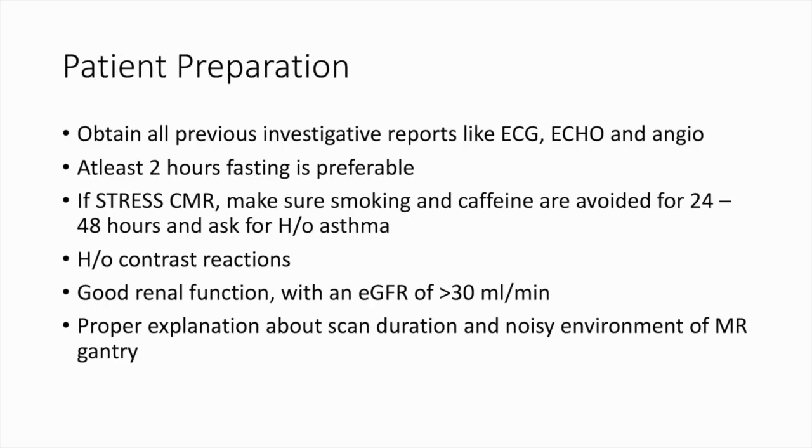Proper patient preparation is an important step in cardiac MR. Always obtain all previous investigative reports like ECG, echo, and angiography. At least 2 hours of fasting is preferable. If stress cardiac MR is contemplated, then make sure there is no smoking or caffeine intake by the patient for at least 24 to 48 hours before the study.